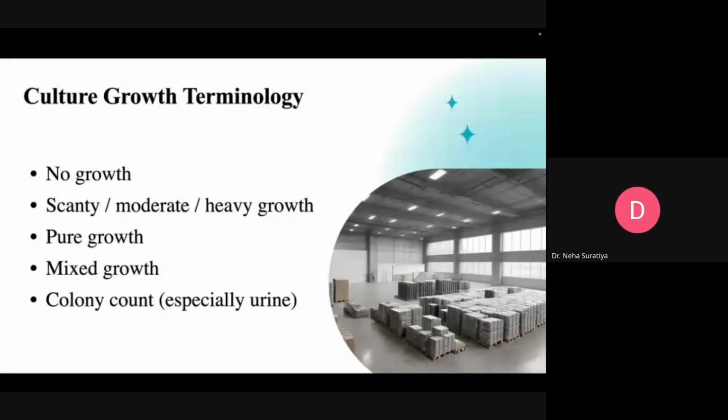So the treatment of urinary infection is also decided accordingly, okay: complicated UTI and uncomplicated UTI. So you need to connect the dots here, okay. This is how colony count appears, and it is always interpreted along with the symptoms. We need to correlate everything with the symptoms. Many times your report is not saying much, and it is not correlating with the symptoms a person is having. In that case, reassurance is required, retest is required, because error chances are very huge, okay. So this is very important.